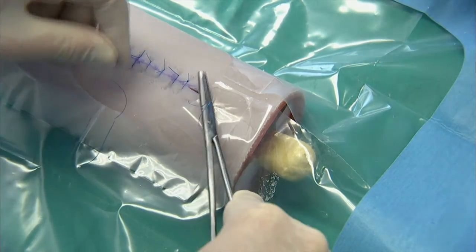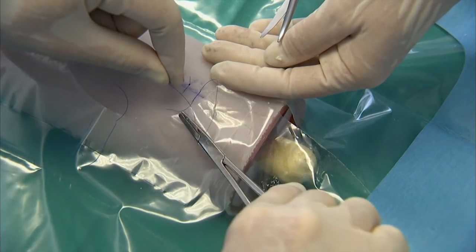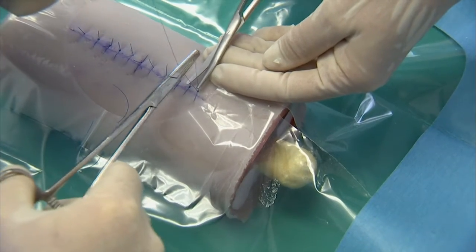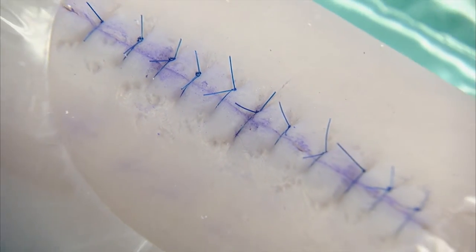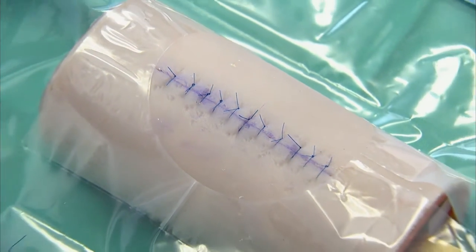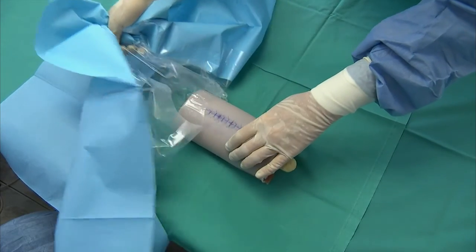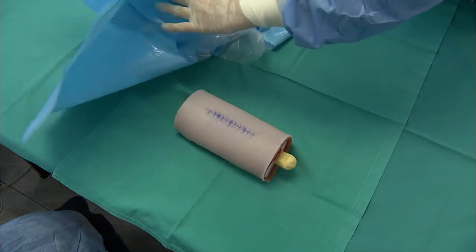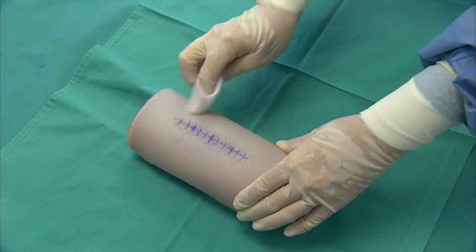The surgeon now ties the suture with a surgeon's knot and ensures that the knot is lying on skin and not on the incision. The assistant cuts the tied suture with suture scissors, leaving 4 to 5 millimeter free ends to facilitate removal at a later stage. Once neatly and securely closed, the operator or assistant follows with cleaning the wound nicely and then allows time for drying. The final step is the application of a suitable dressing by the assistant.